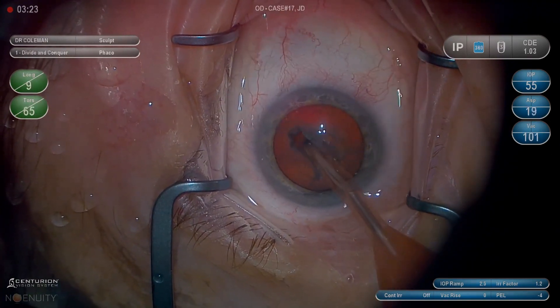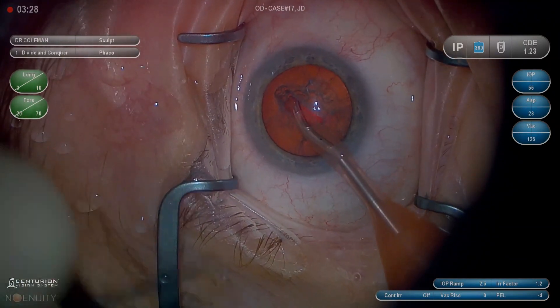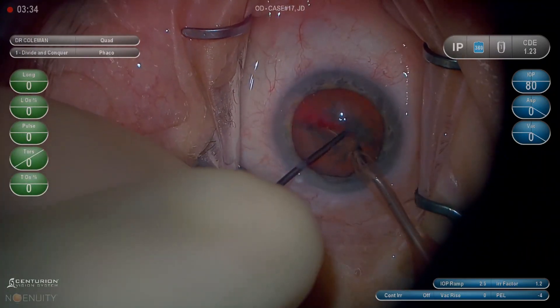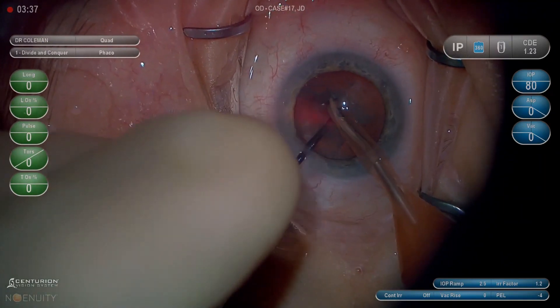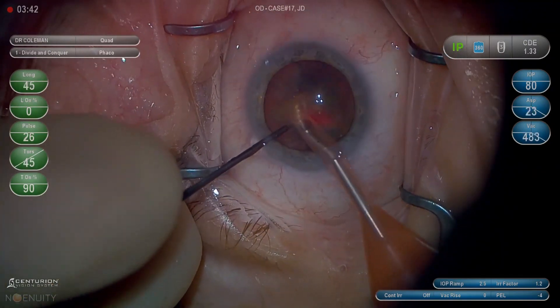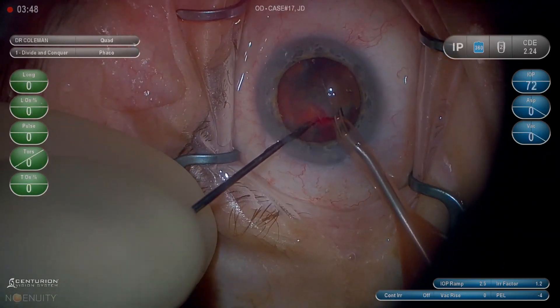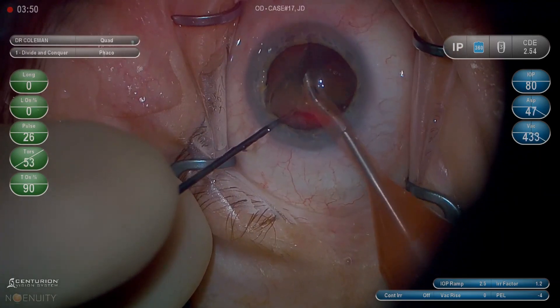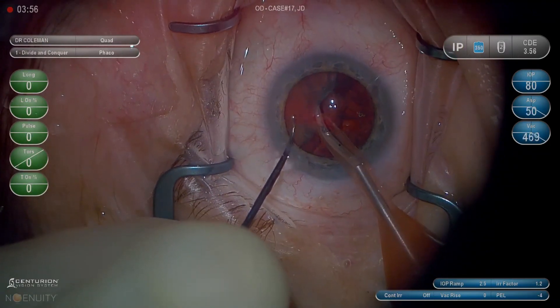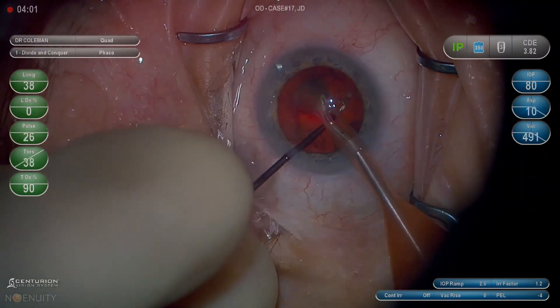I'm going to sculpt first. The phaco tip is, depending on what machine you use, about 1 to 1.2 millimeters, and a lens is almost always greater than 3 millimeters thick. So you basically have three passes sculpting with pretty much impunity — it's going to be difficult to rupture a capsule with three full-thickness passes in sculpt. I see people being really timid on the first pass or second pass. After the third pass is the time to be timid, but in the first three passes you can really be aggressive and take a full-thickness bite, and that'll save you some time.